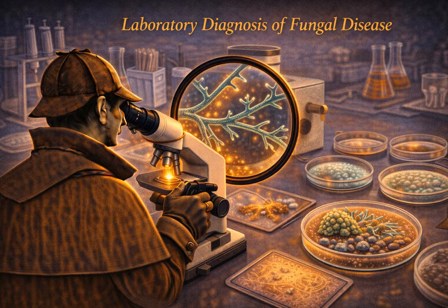They're very elusive organisms in the lab, so the protocol in a clinical lab is non-negotiable. You must use paired media. You always set up one plate with cycloheximide to kill the weeds and one plate without cycloheximide to catch the sensitive pathogens. You need both views to get the full picture of what's in that sample. Makes perfect sense. Redundancy is safety in the lab.